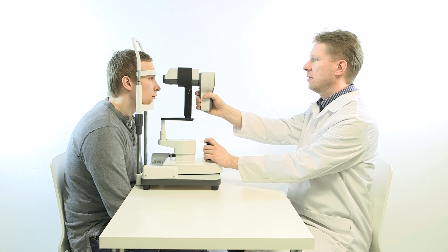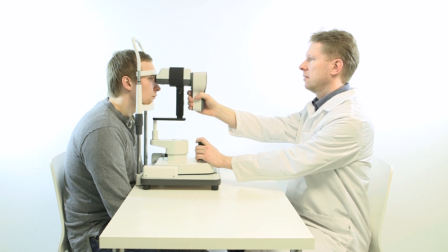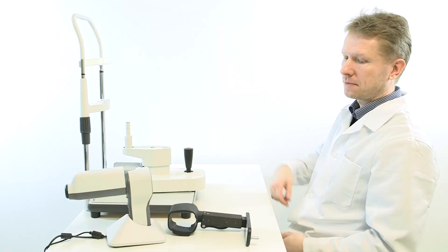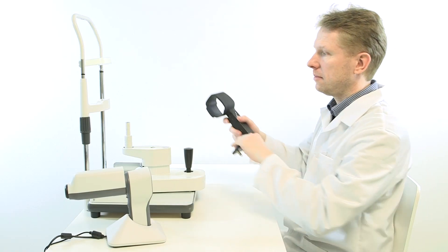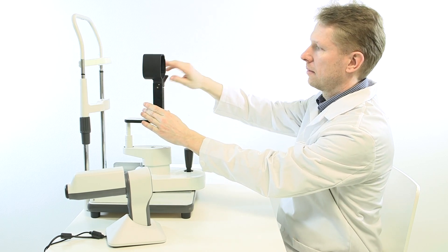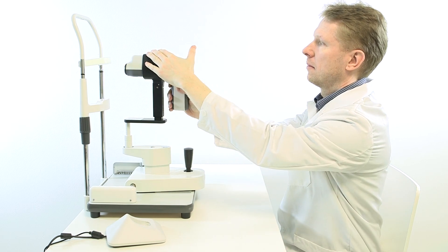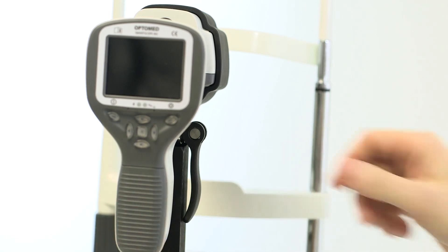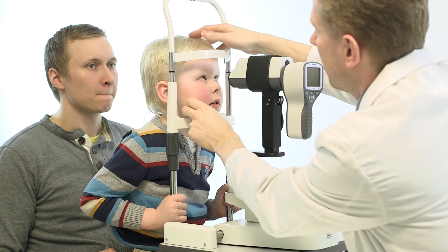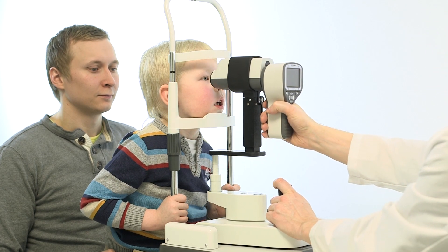Prepare for the examination by making the room as dark as possible. It is recommended that both patient and doctor sit down during examination and the camera is mounted on a slit lamp stand by using the slit lamp adapter. The adapter is placed on the slit lamp by mounting the adapter axle to the slit lamp holder. Pull down the latch to fasten the camera and optics. This will give ultimate stability for imaging as the patient's head is secured and will enable the sharpest possible images.